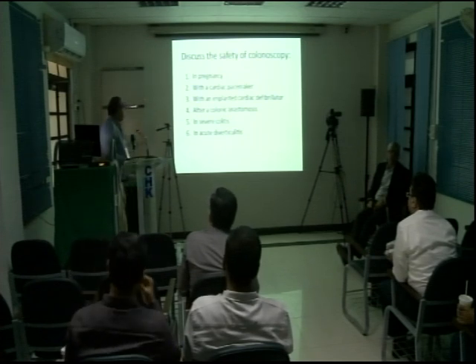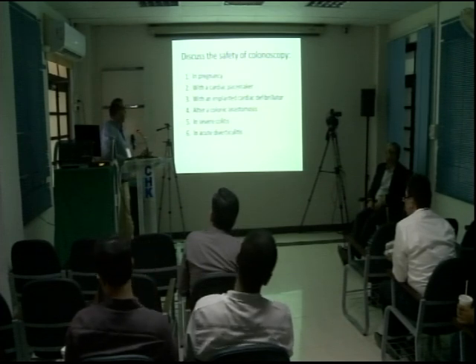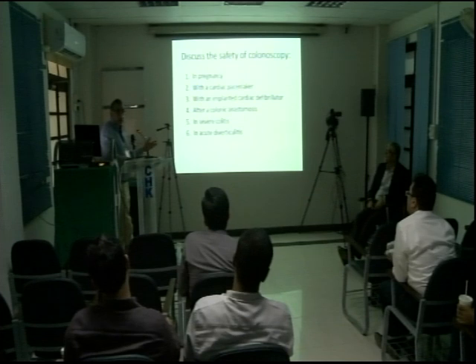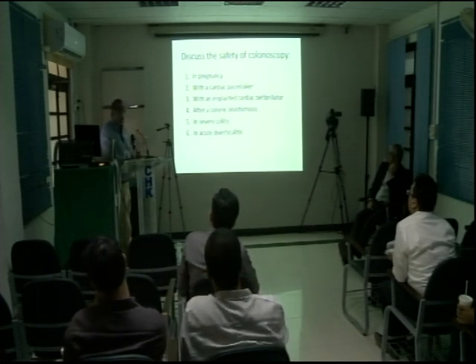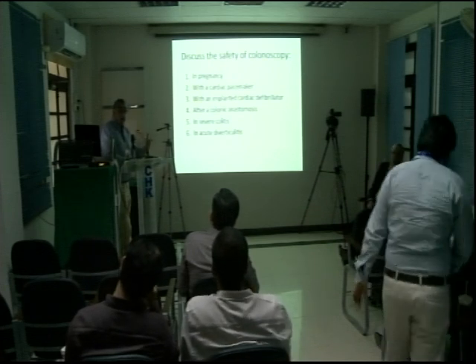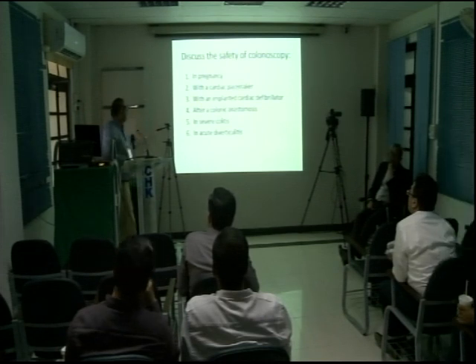After colonic anastomosis, again you have to be careful. Immediately after surgery it's contraindicated. If it is recent and the surgeon insists that you check for him, it has to be done by an experienced colonoscopist who uses very little air insufflation, because a lot of things can happen with barotrauma. When you insufflate air, mucosal lesions often occur and bleeding can also happen, so you have to be careful.